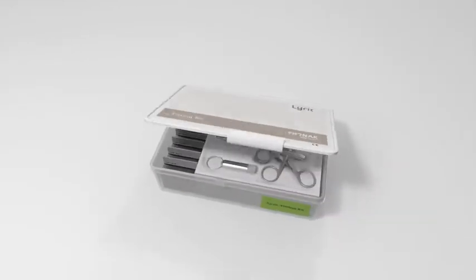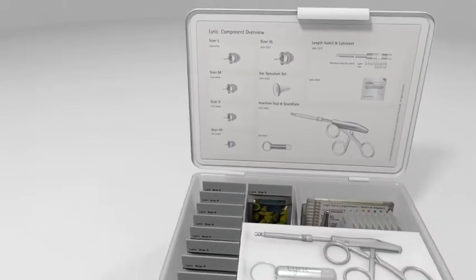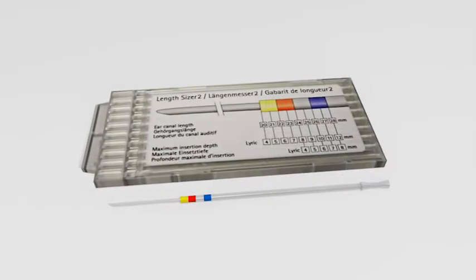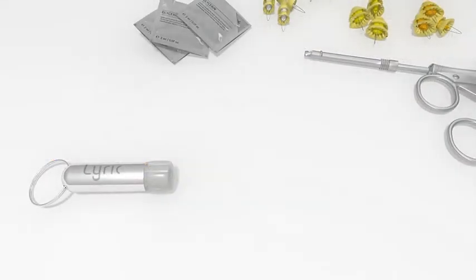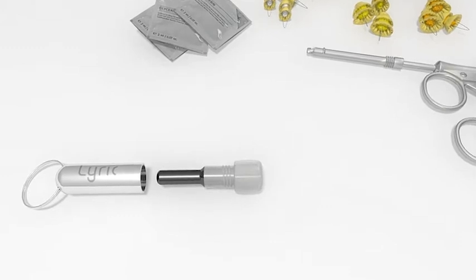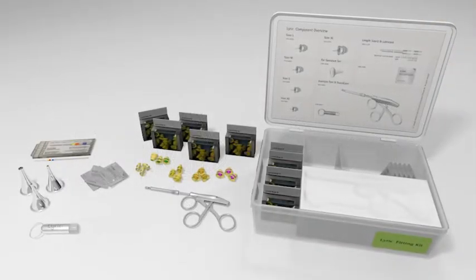To size and fit a patient with Lyric, you will use the Lyric Fitting Kit provided by Phonak. It contains all of the necessary supplies, including length sizers to measure the maximum depth of insertion, device sizers to determine the correct device size, lubricant and an insertion tool for sizer and device insertion, a sound link to control the devices, and speculums to aid with otoscopy.